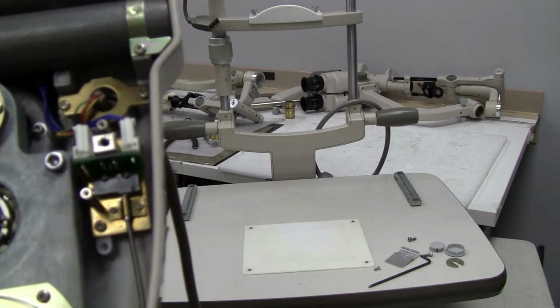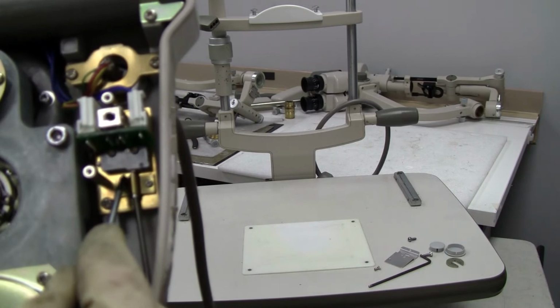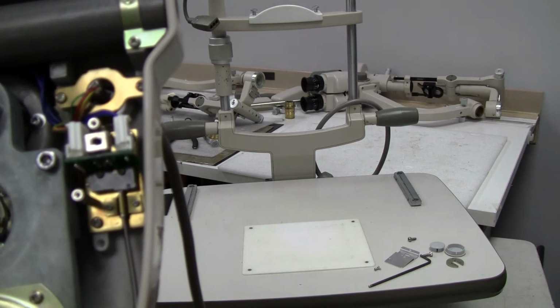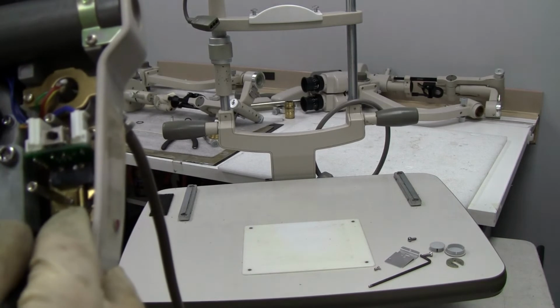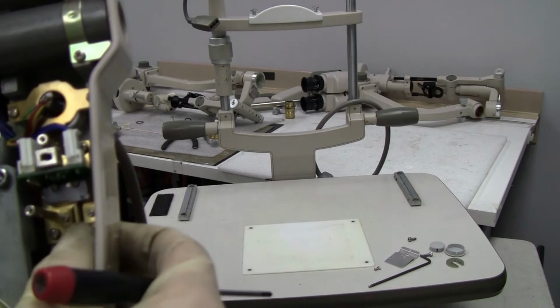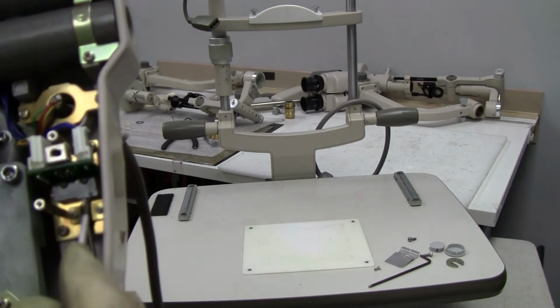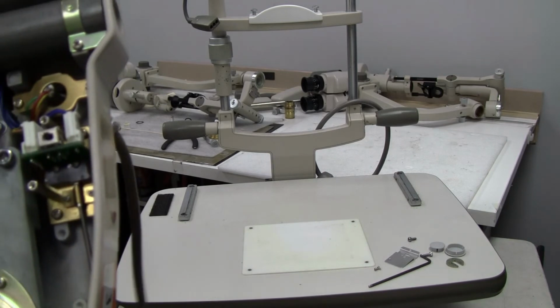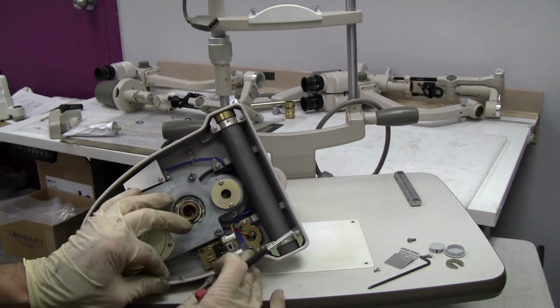So when you put it back on, you want to put it where it just barely touches the switch, so that with a little bit of effort, it engages the switch. You can adjust it by loosening and then pushing it forward or backward so that at its resting position it is just barely touching the switch. All right, just loosen it and then it'll come right on out.